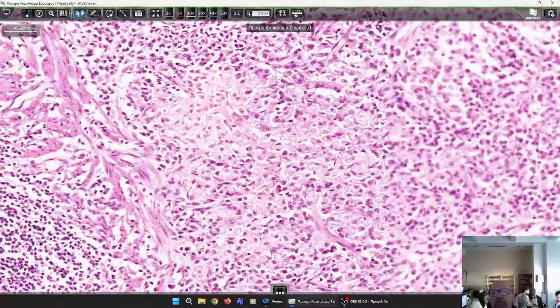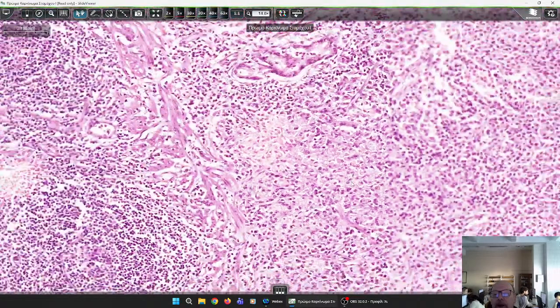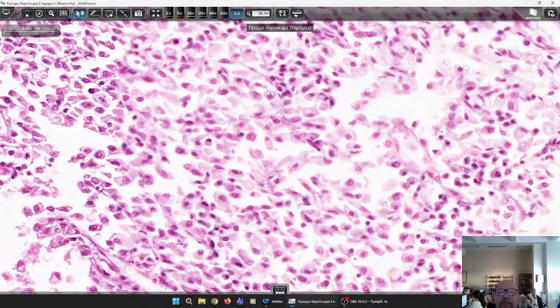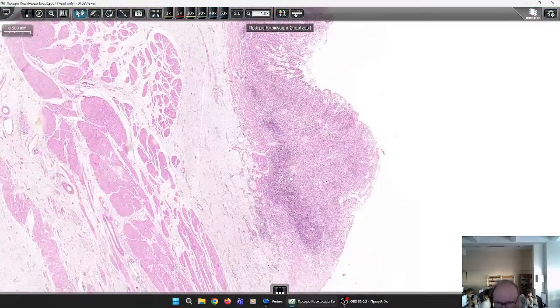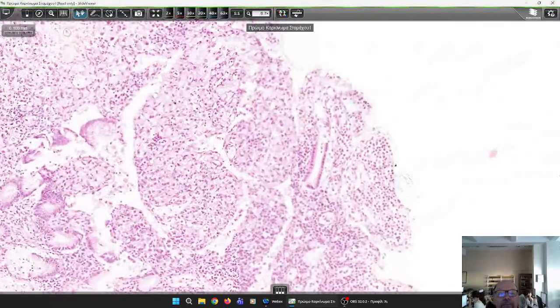And this makes you suspicious. Now, have a look at these cells here. Here we see plasmacytes. Okay, we have inflammation. This might be an eosinophil. However, there are some cells that you cannot tell what they are, these cells here. So you must perform an immunohistochemical stain against cytokeratins.